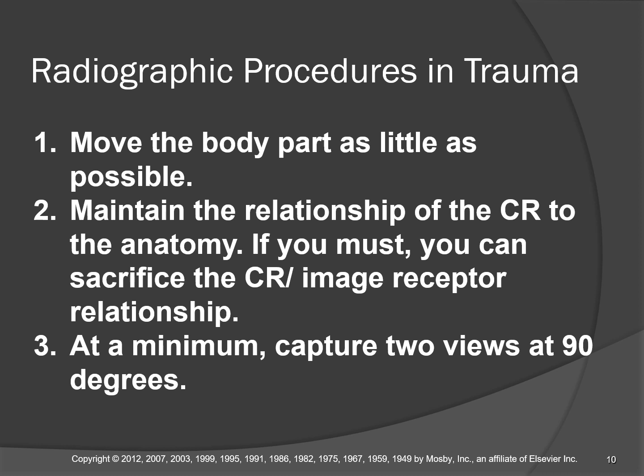And so for 5 exposures, you can get the equivalent of an AP, lateral, and both obliques. And the elbow doesn't move out of 90 degrees of flexion for that. Four different diagnostic views across 5 different images without moving the body part. That's the essence of trauma. So we move the body part as little as possible.